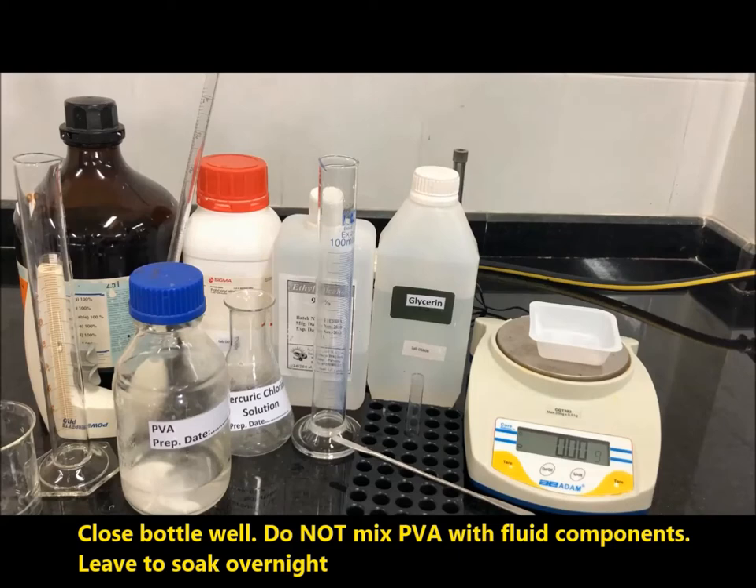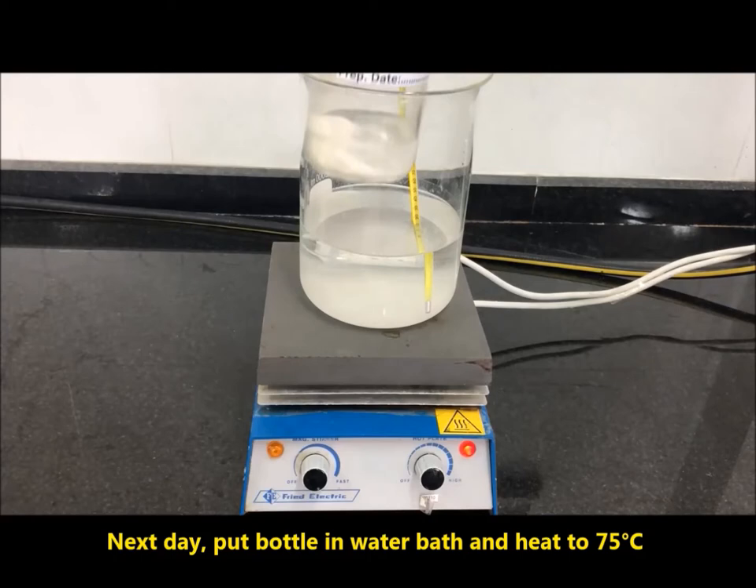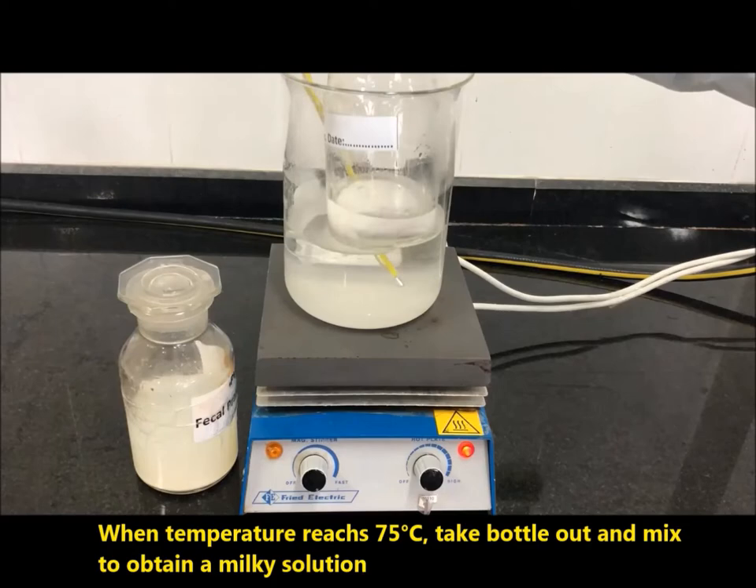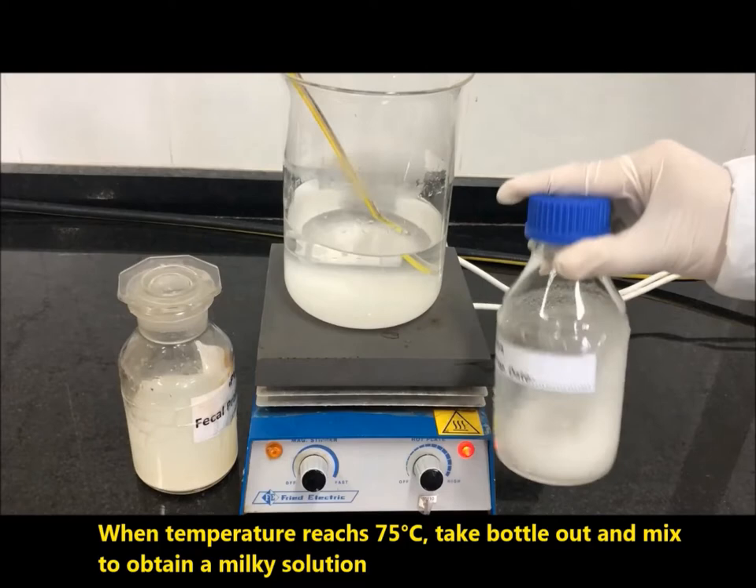Next day, put the bottle in a water bath and heat to 75 degrees centigrade. When the temperature reaches 75 degrees centigrade, take the bottle out and mix to obtain a milky solution.